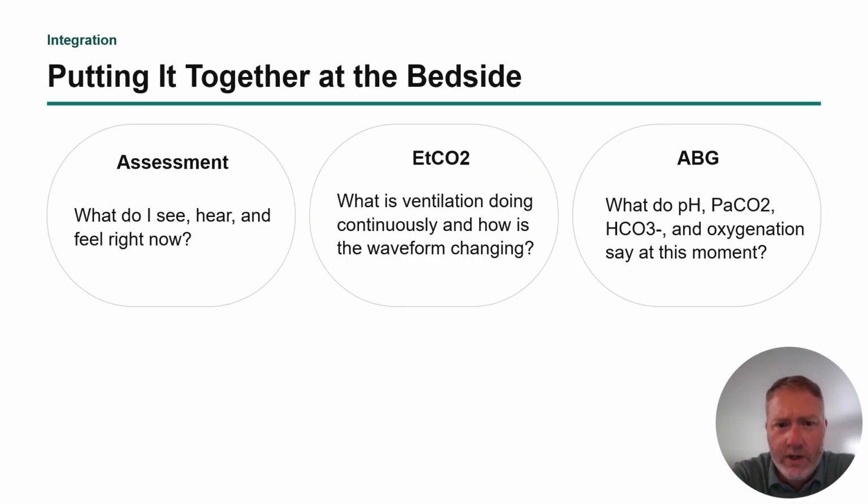So to put all these things together at the bedside, whether it's at a hospital that you're picking the patient up at, or if it's their house, or if it's in the back of the bus or helicopter, whatever the case may be, if you look at these three components when you have somebody who has an airway or breathing difficulty, then locking them all together is something that will greatly benefit you in determining the overall picture, the big picture, and what's going on with the patient.